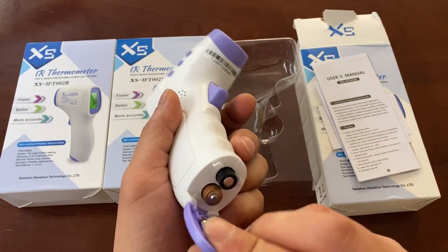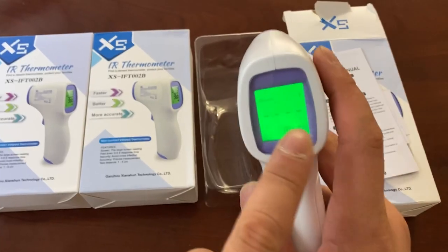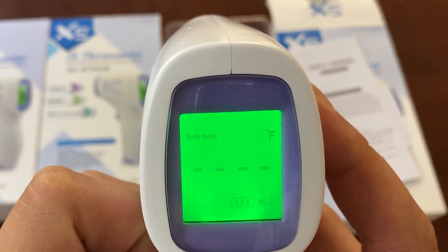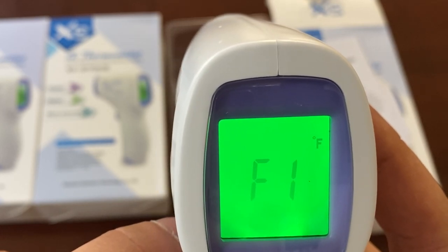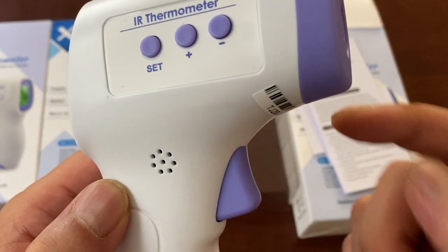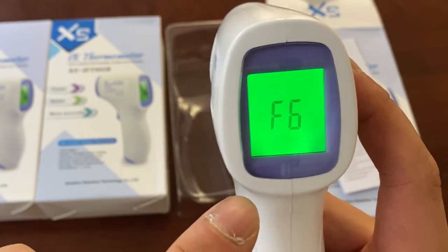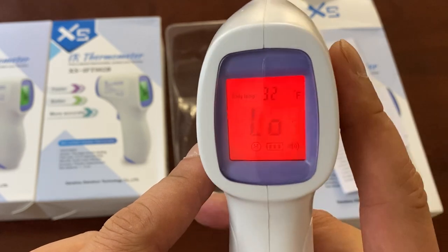We already placed the batteries in here. Literally, you just scan. I already set this up so it reads in Fahrenheit. By default, when you first purchase this, it's actually set to Celsius. To set it, you turn it on by pressing this trigger right here. Then you hold this set button and it'll self-cycle through different save settings. You can actually choose to use one setting for Celsius and one for Fahrenheit if you wish.